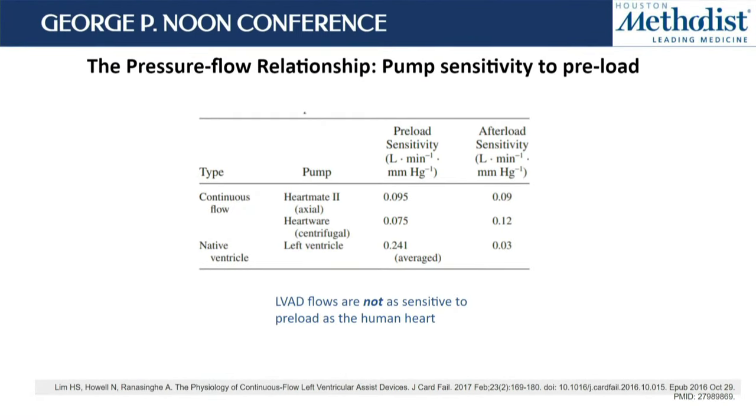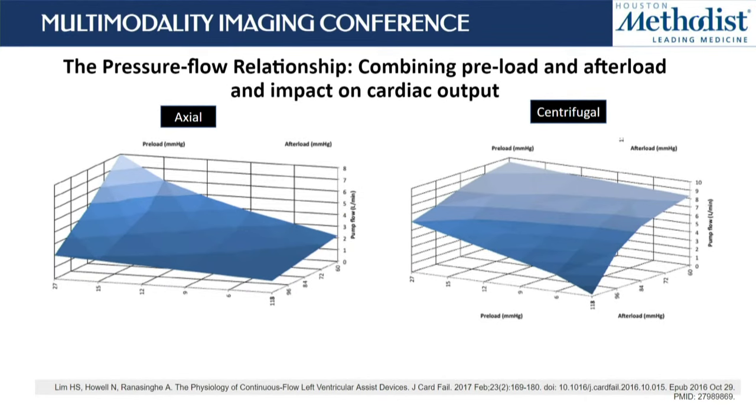So because blood pressure is a very important component of what we do. The pumps are sensitive to preload, but not as much. Sometimes we are surprised at looking at an LVAD patient walking around with a very low hemoglobin, and trust me, this is true of HeartMate 3, without having significant issues, and you wonder why that happens. It's because the pumps are not as preload sensitive. Yes, you see alarms, but they're still able to maintain an output, surprisingly enough.